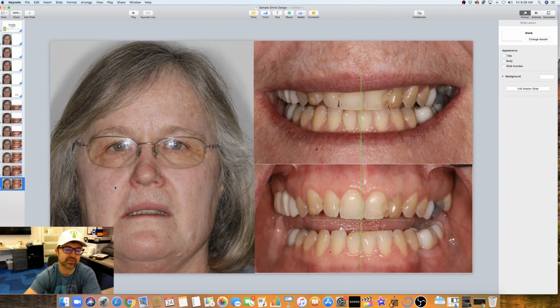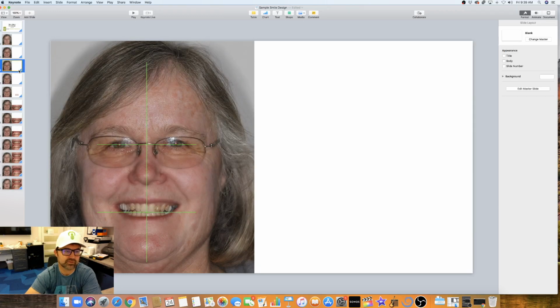So as you can see with this patient, even if we go back to this slide or this one, let's look at her proportions in her face. Now again, hopefully we've lined up the photo correctly, but her nose is not perfectly symmetric. Could be positioned a little bit to her right. Looks like she's had some cancer removed on her nose. You look at her lips, they do not flow evenly on the way they rise. The left side is a little bit more elevated than the right side.